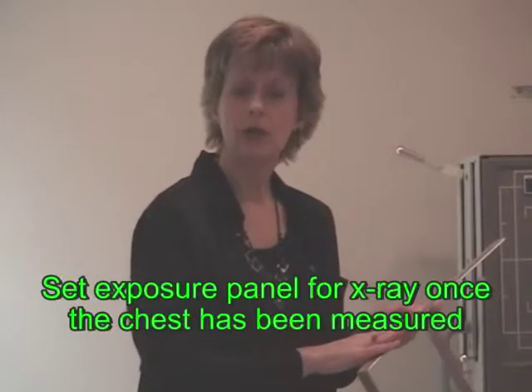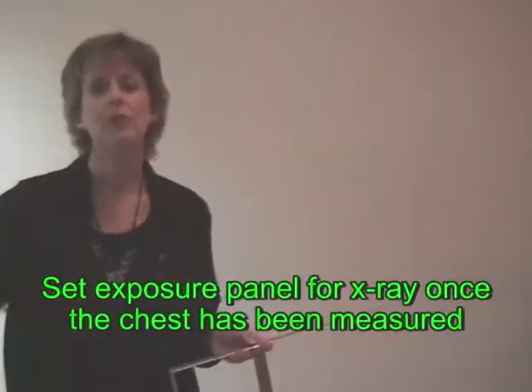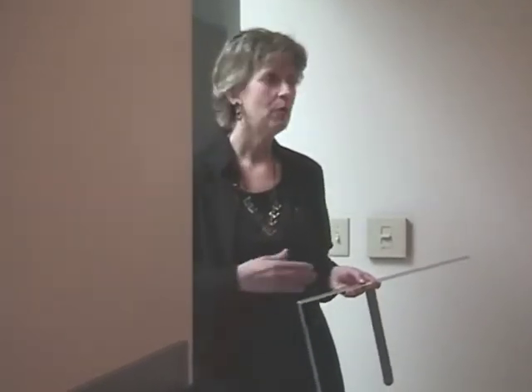I will look 20 centimeters up, and the chart will then tell me how much MA, time, and kilovolts to set. So after you measure the patient, you need to go set your exposure panel. The exposure panel is outside the room. We set those factors. We want the factors set before we actually position the patient.